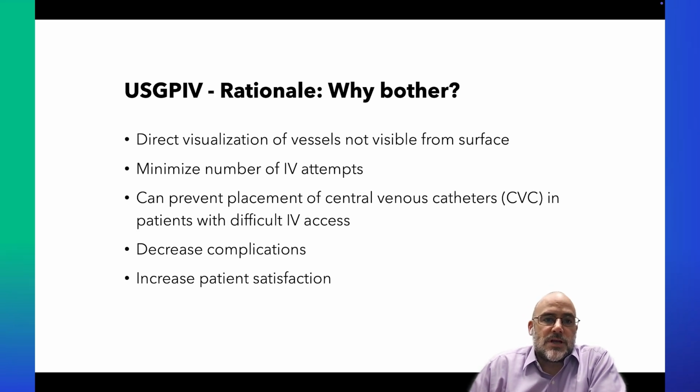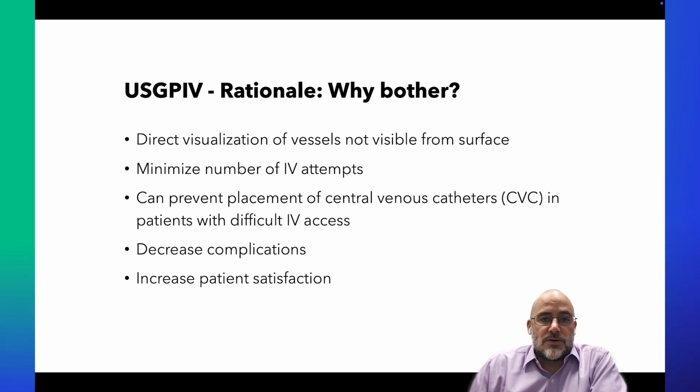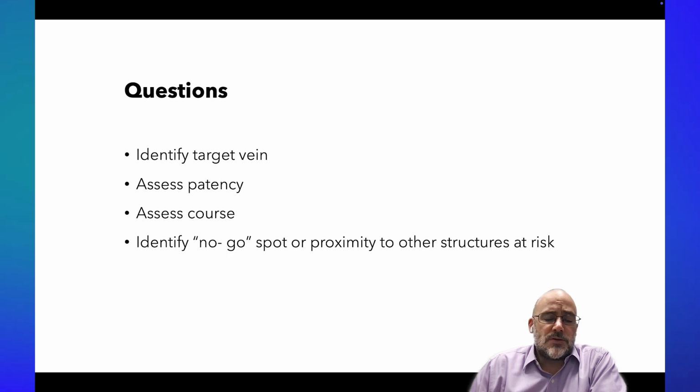So the rationale for ultrasound-guided IVs, one, it increases the number of spots available to you. You can visualize the vessels that are not palpable or visible on the surface. Two, there's evidence to suggest that ultrasound minimizes the number of IV attempts before successful cannulation. Three, it's possible that with better access, it can decrease the number of times that a CVC, or central venous catheter, needs to be used. It can decrease some complications, but we'll talk about the fact that it raises the incidence of others, and also it increases patient satisfaction.